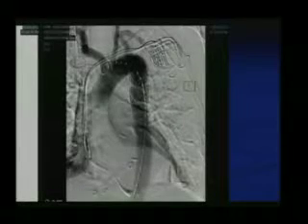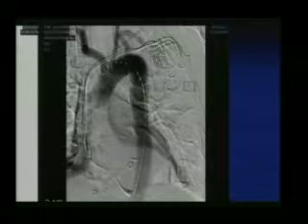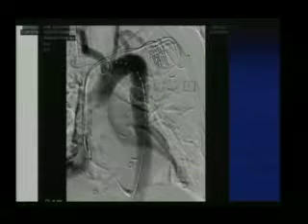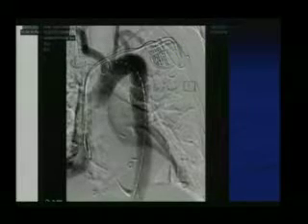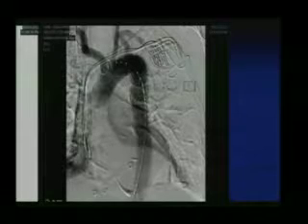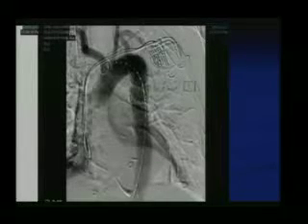We did obtain a follow-up CTA on this patient, and that demonstrated all the arch vessels were filling. The left subclavian was also filling, but there was partial coverage of the open part of the stent graft on the subclavian, with no evidence of endoleak and successful exclusion of the injury. So this was my first local anesthetic percutaneous repair. And he did okay. He is discharged home now.